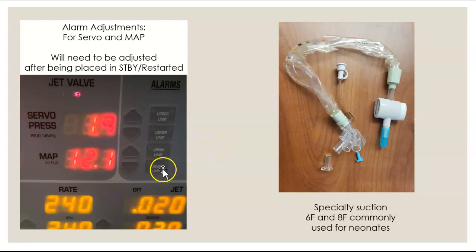Don't overthink it, think 1980s tech, everybody. Hold it till you get the number you want. But yeah, it will lock you out if you try to adjust it before the ready light. It'll just be like, nah, we're not ready for this.